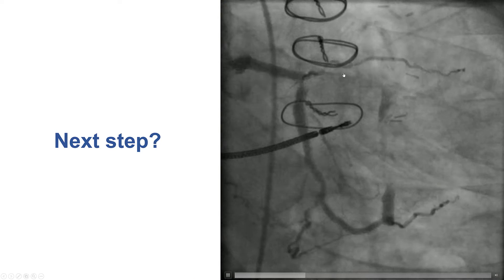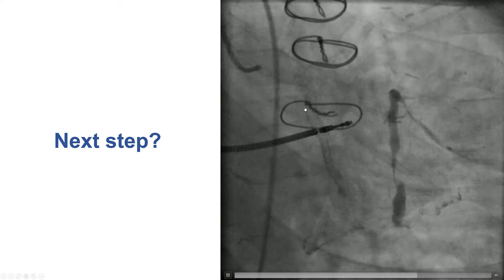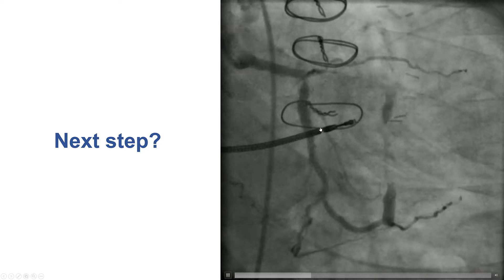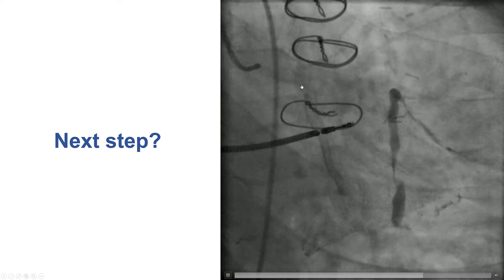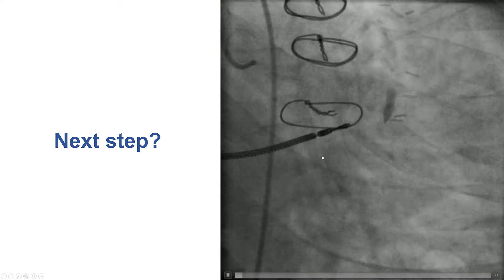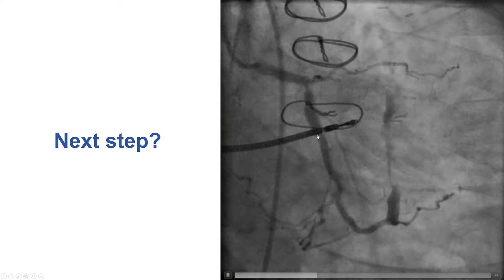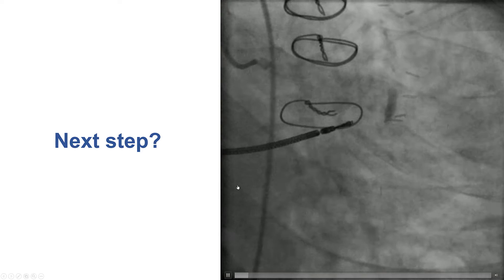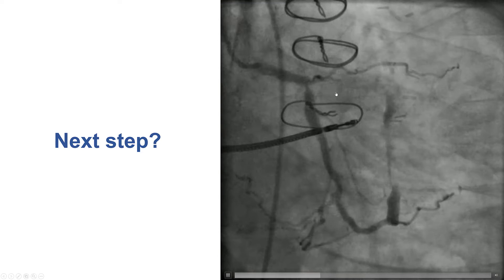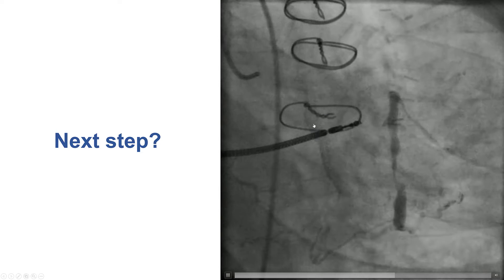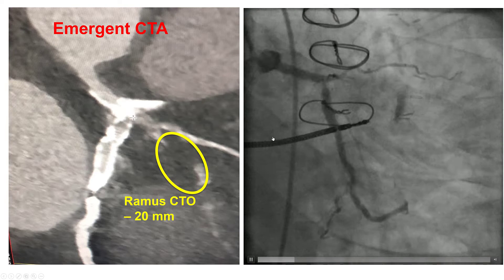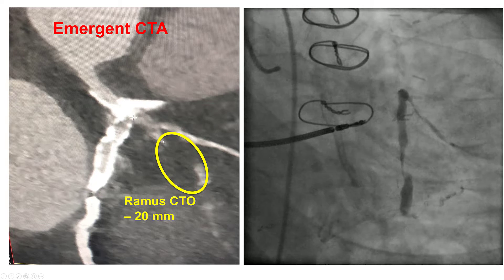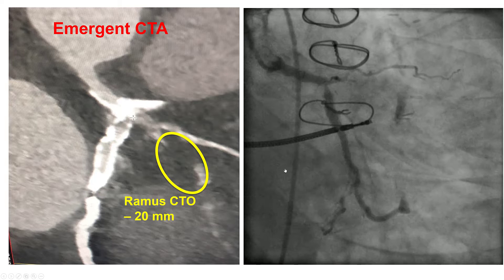Going back, there is essentially an ambiguous proximal cap. This is the 1st obtuse marginal, but we don't really know where it's originating from the circumflex, which is also covered with stents, making IVUS very challenging to determine the proximal cap. Another option here would be to do a CT angiogram to determine the location of the proximal cap, and that's exactly what we did. What we found is that it was actually a RAMUS that was more proximal to this vessel.